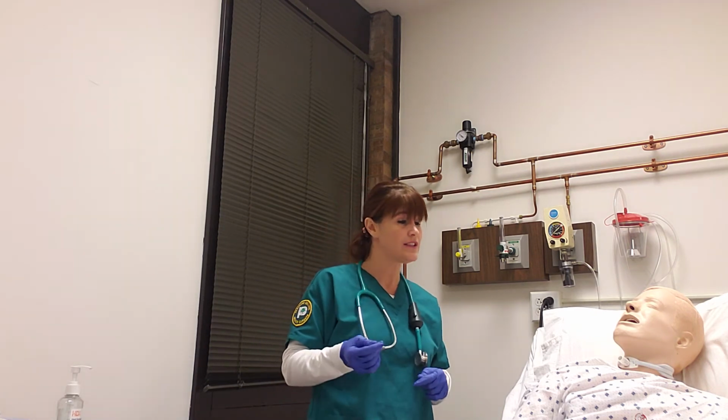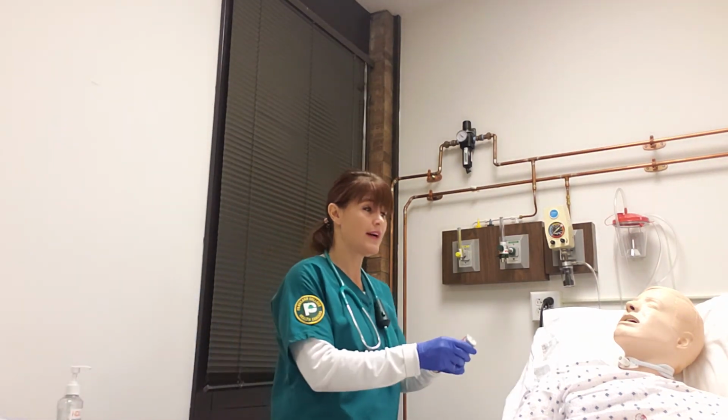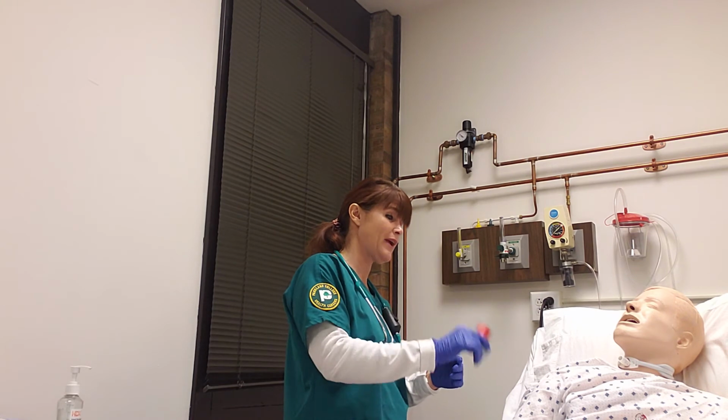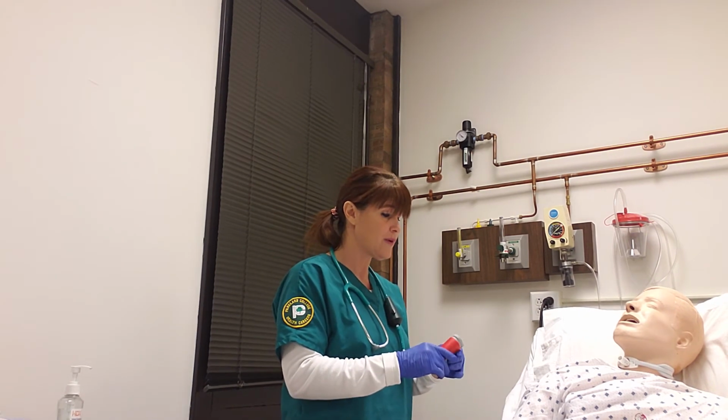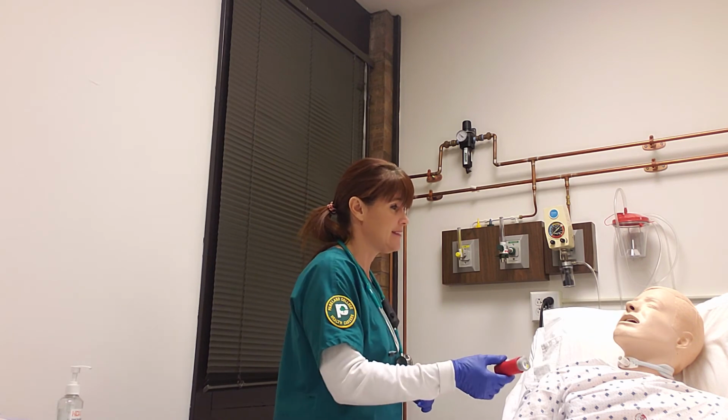All right, so what I want you to do is I want you to do this the first time so I know that you know what you're doing. I want you to pretend you went to the pharmacy, you just got home. I want you to show me how to prime it, you know, how you know when it runs out and how to properly take the medicine. Okay? All right, thank you.